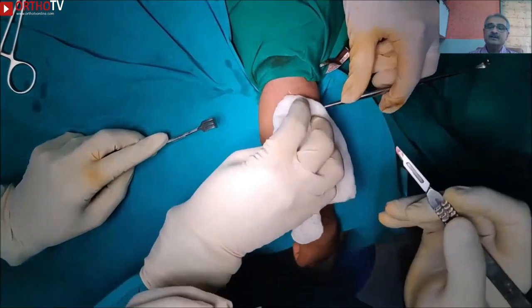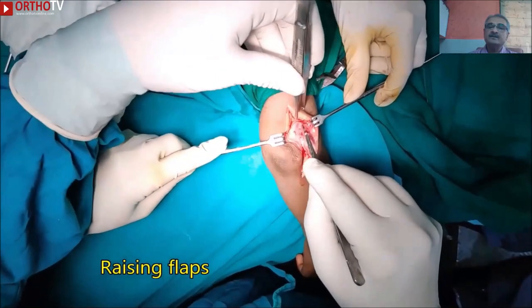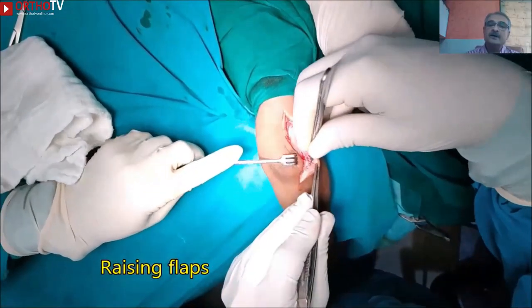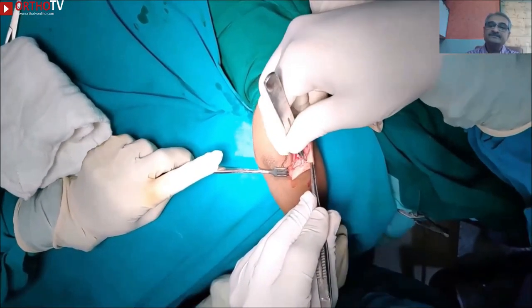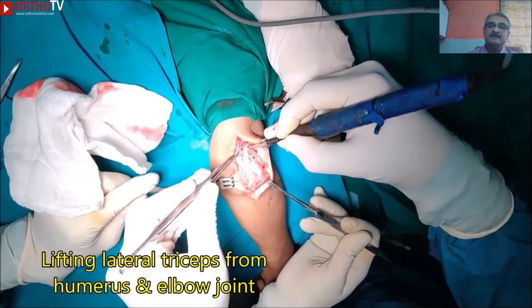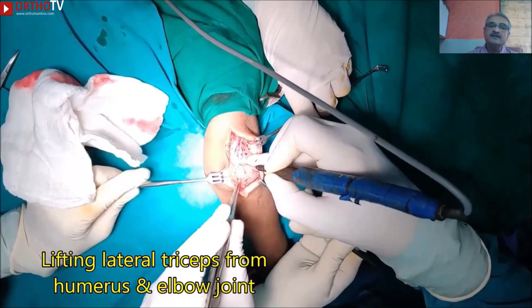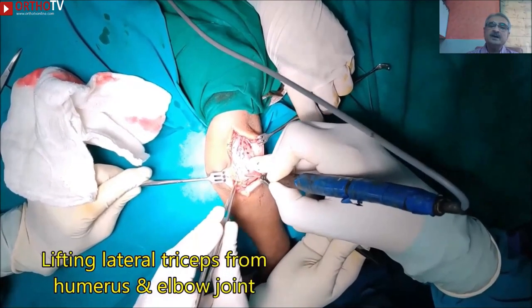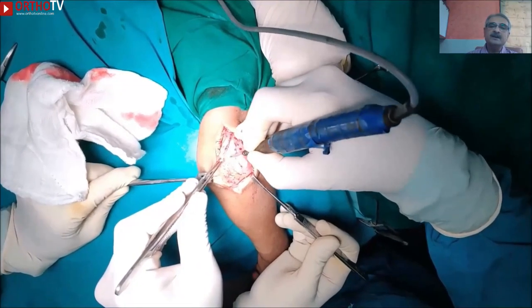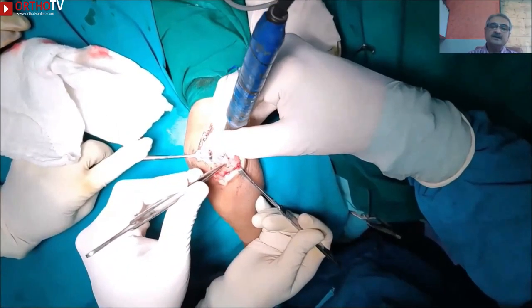After the incision and hemostasis, the first thing we need to do is raise the flap. The first flap we raise is on the lateral side to reach the outermost aspect of the lateral border of the triceps. A meticulous dissection will help with hemostasis as well as better delineation of the fractured fragments.